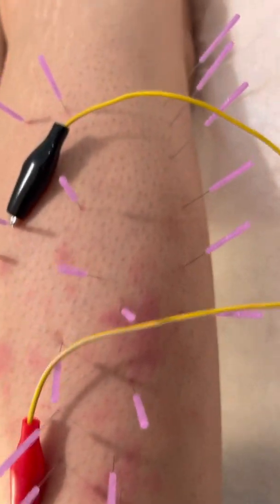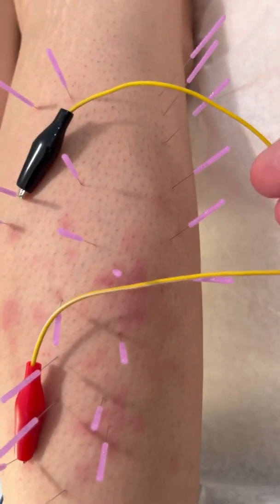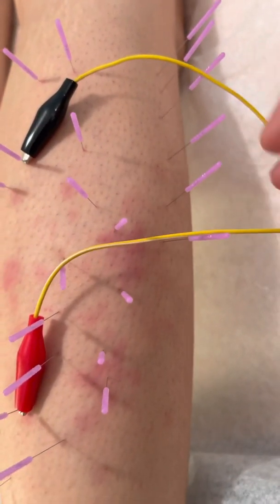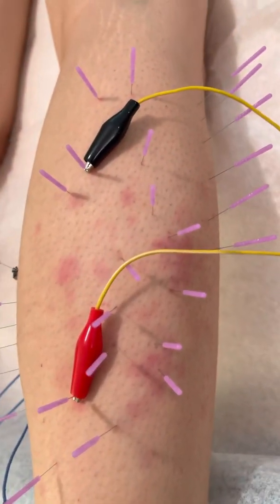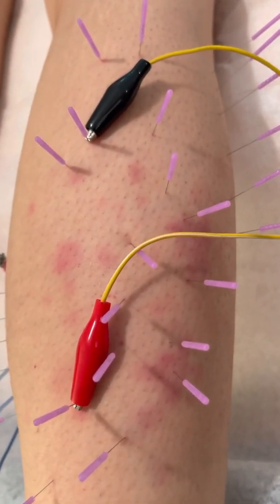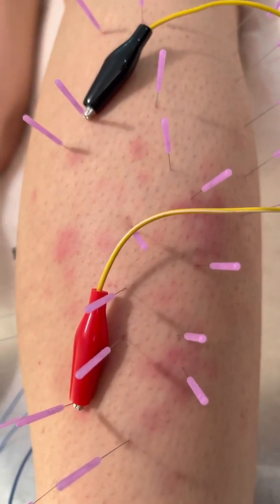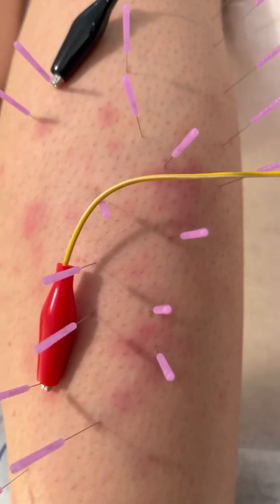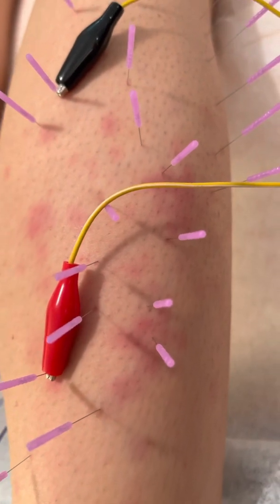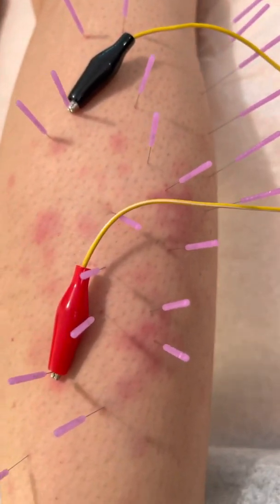And what I've done here is I've needled the motor point of the peroneus longus. I've needled various points along the peroneus longus that she identified. You see all these red marks? That's from her doing self-massage before the treatment. So we already know that this is somebody that likes stronger needling. These are number 5. I forget the gauge of these needles, but these are the thicker needles.